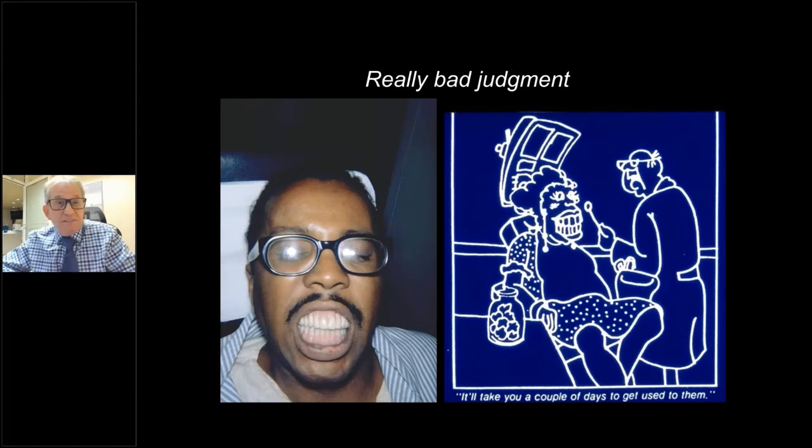Here's another patient, same place. Again, Buffalo did not make these teeth, VA there, they didn't make these. But I want you to look, and I want to just bring out a few little points. When you're looking at this smile, we even asked him, could he close his lips together? And he could not.